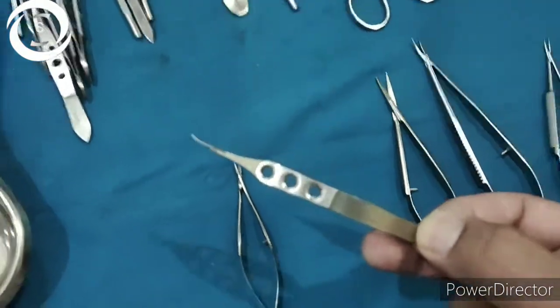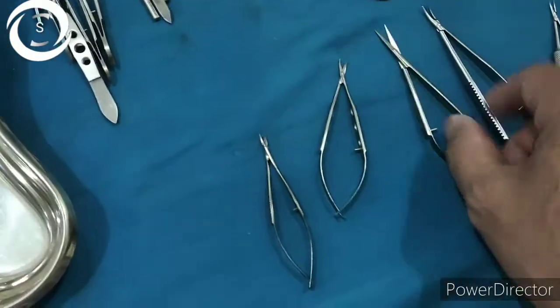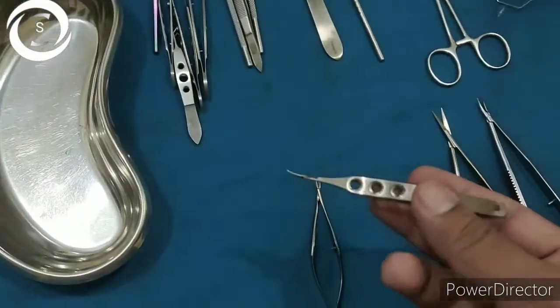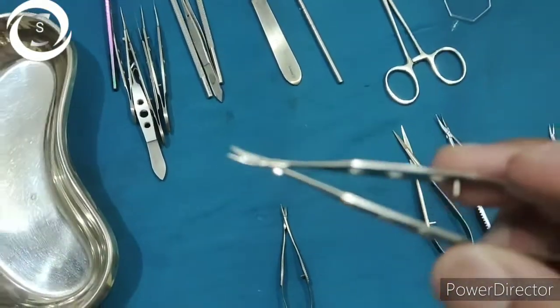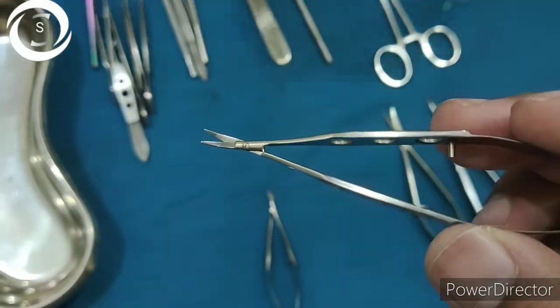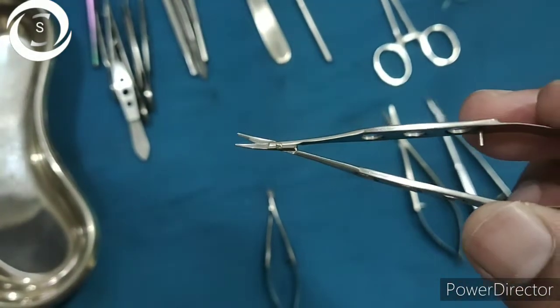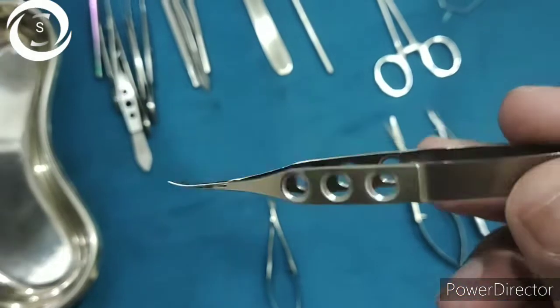This intermediate-size scissor is called the corneal scissor. You can see the round holes in its handle, just like a cornea. It is mainly used to cut the cornea during intracapsular as well as extracapsular cataract surgery. You hold it like a pen and it also has sharp blades.